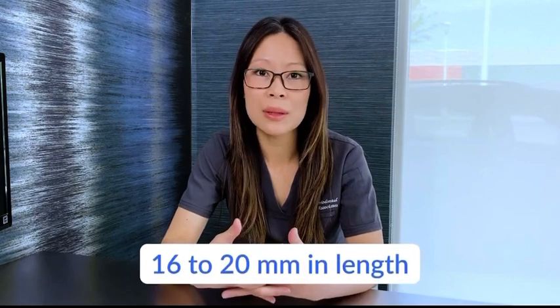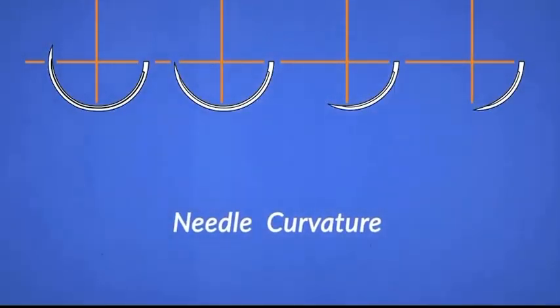If you're using it for larger wounds or more resistant soft tissue, you might opt for a bigger needle, either 16 to 20 millimeters long. Longer needles also have a larger diameter and they are easier to handle. However, when the size is larger, the puncture wound that it creates in the tissue will also be larger. If you are operating on smaller and more delicate tissues, you may opt for a smaller suture size or needle size.